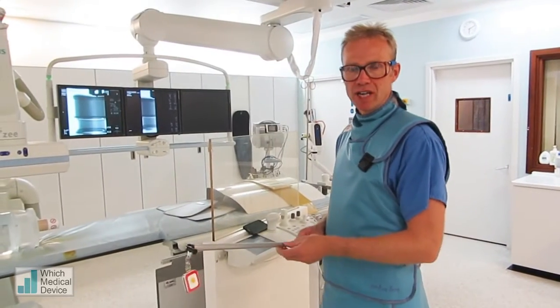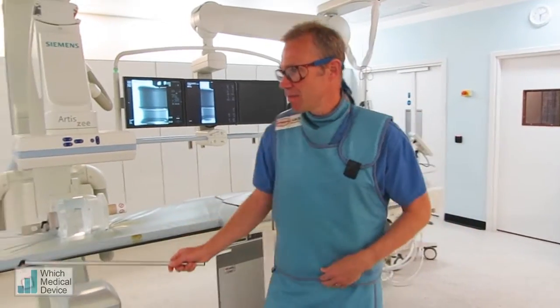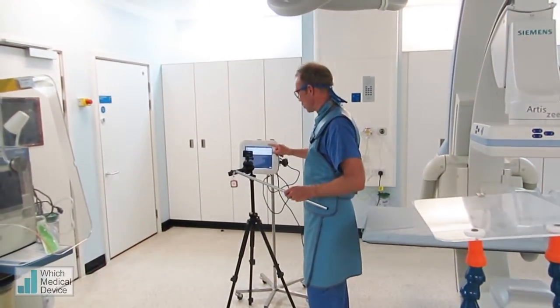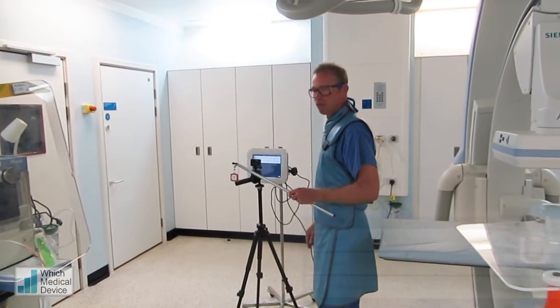What we've got here is the I2 radiation real-time radiation dosimetry system, which you can just see over here. We've got four badges which are connected to this system via Bluetooth, and these will give a real-time readout of radiation, actually as you're screening and performing procedures.